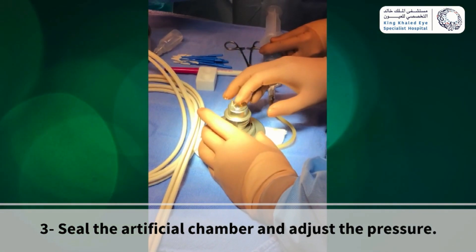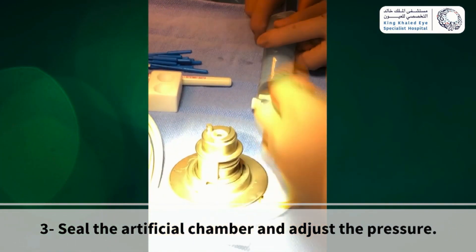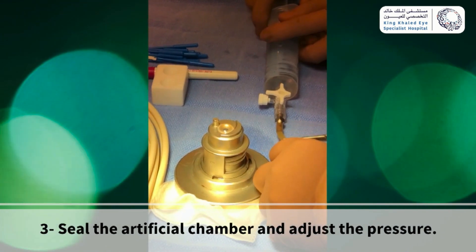With a sterile gloved finger, touch the top of the cornea gently to check if there is adequate pressure to perform the procedure. Then clamp the BSS tube.